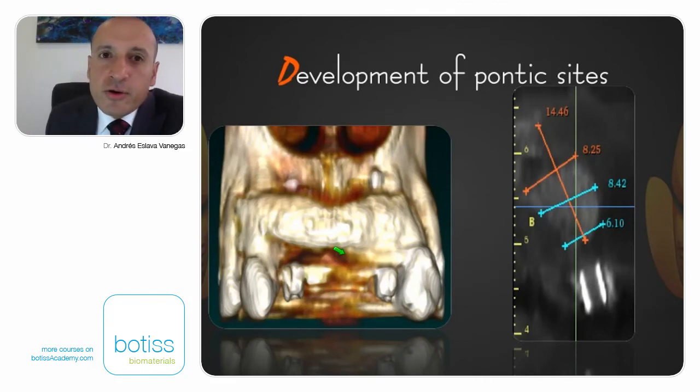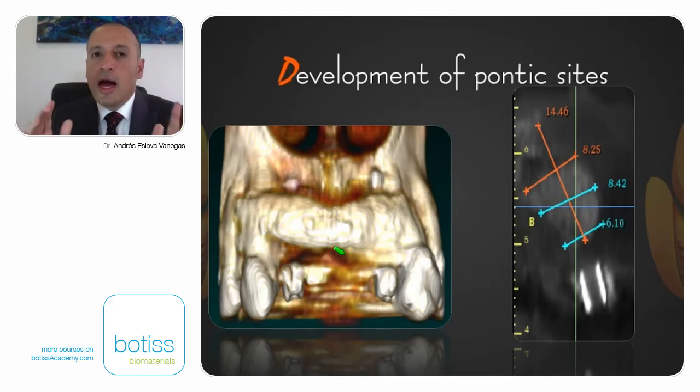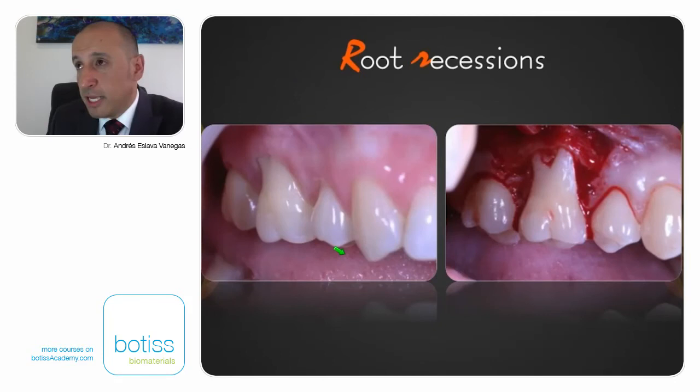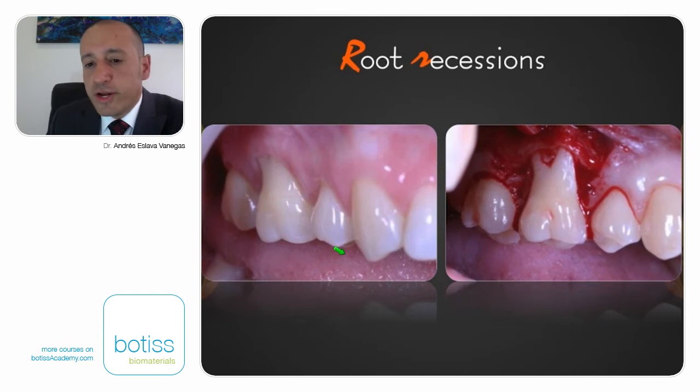9 to 10 months later, we want to see what was happening in there. And you can see this. That was the bone graft that we used. And look, what is the thickness of this graft? 6.1, 8.2, 8.5, 8.25 millimeters. So we can do a real guided bone regeneration using dermal graft. And this was maybe 6 to 7 years ago. Okay, we're going to cover guided bone regeneration further along in the presentation.